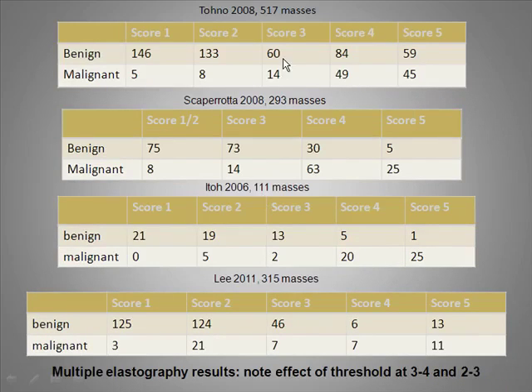Again, a number of studies tabulated benign and malignant against elasticity scores, but did not utilize the morphologic assessment as another criterion. So for these soft cancers where elasticity was false negative, we don't know what they looked like morphologically.